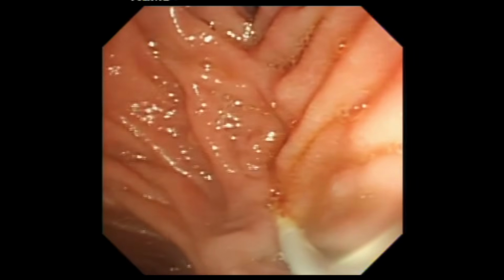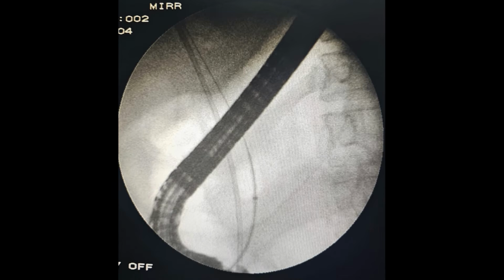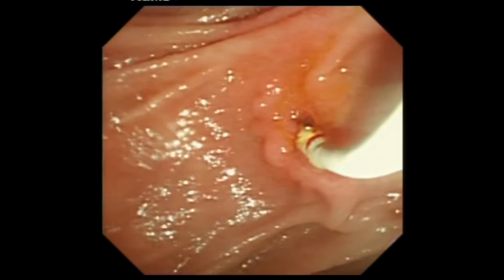The position of the balloon relative to the stent is now being confirmed with the use of fluoroscopy. And as you can see in this adjoining image, the black dot represents the position of the balloon, and the long CBD stent is also seen lying within the lumen of the duct.